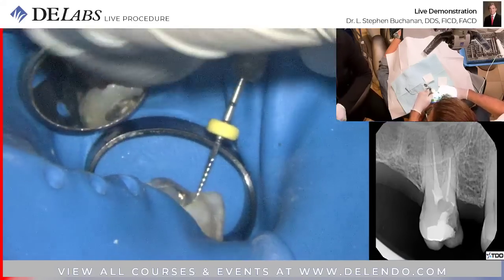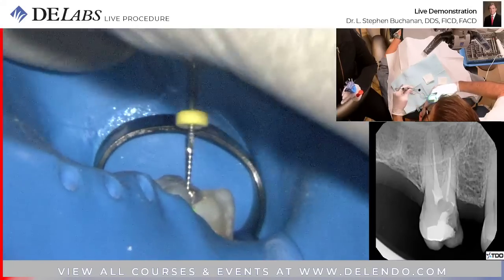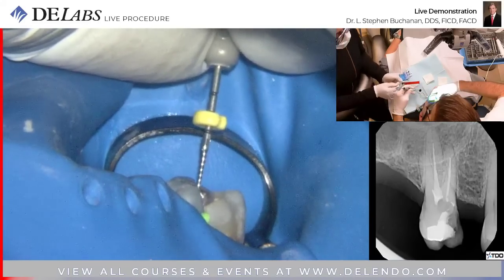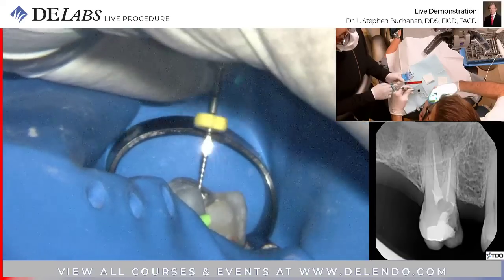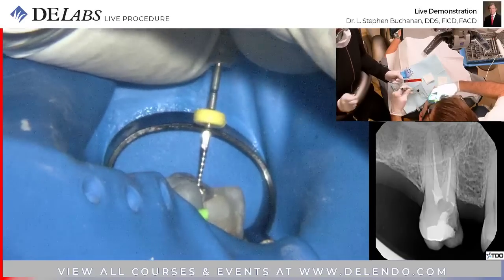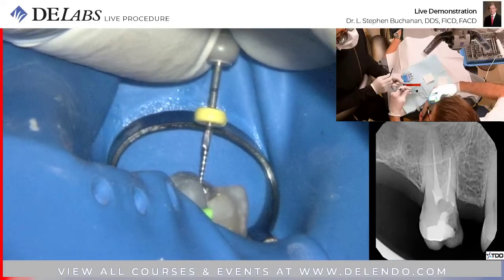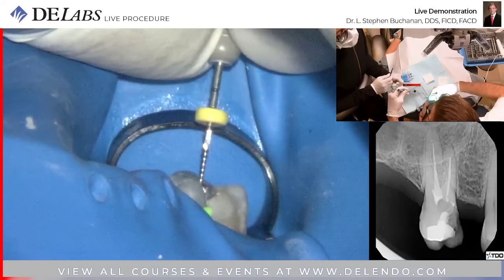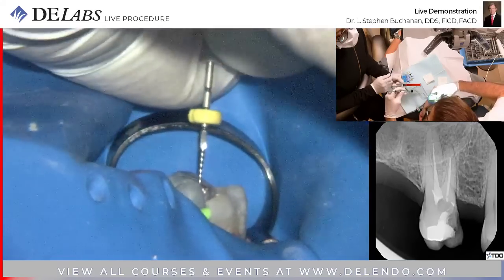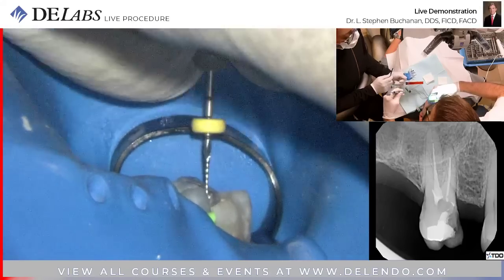Most likely that's where the curvature takes us. Let's see if watch winding this thing is going to get us any deeper. I feel a slight tug back, that's good. Let's put a 6 in there and see what happens.